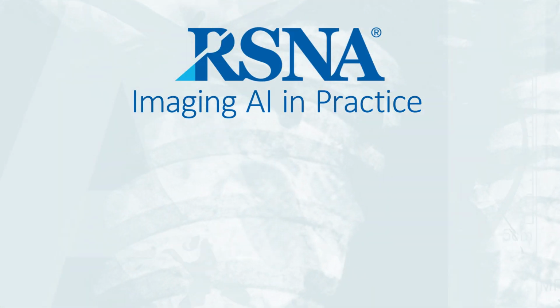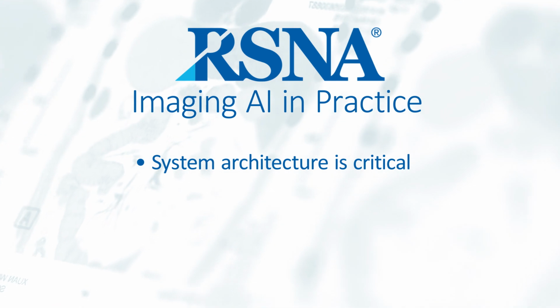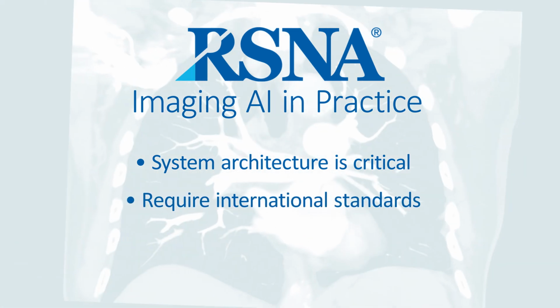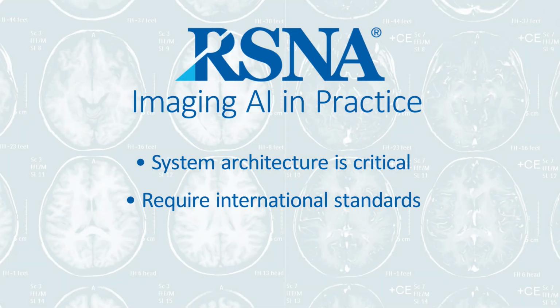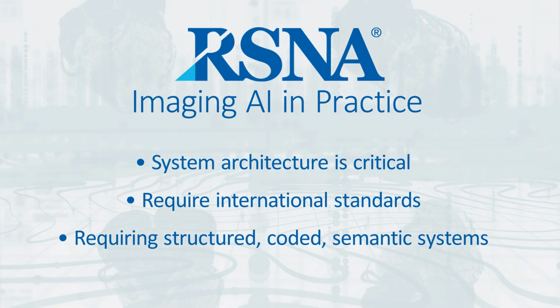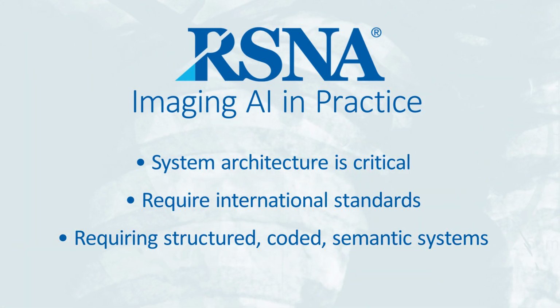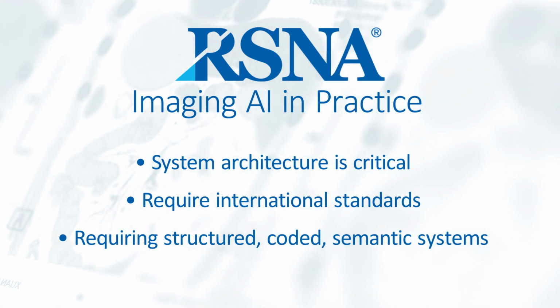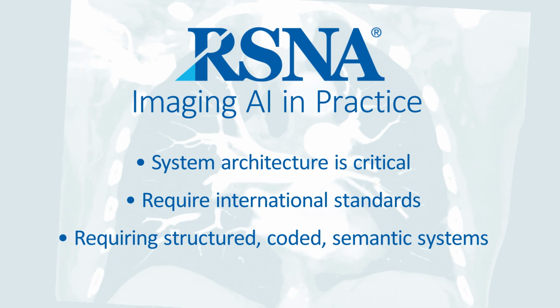As a conclusion, we hope you consider the following takeaways. The architecture of overall system for your hospital is critical. Requiring international standards such as IHE, DICOM, HL7, or FHIR will enable interoperability. Requiring structured, coded semantic systems such as RADLEX, LOINC, and SNOMED will make the AI and other data flow through your system. You need to ask all of these in every RFP for every system.